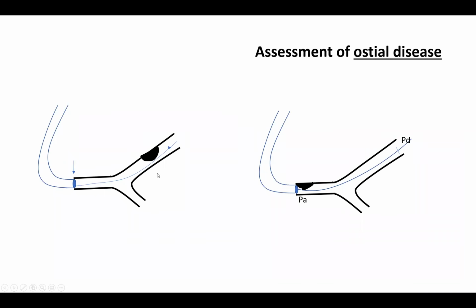So along those same lines of ostial obstruction, how about the patient I was describing, assessing a distal lesion through a moderate ostial disease and ventricularization? How about if you want to assess a more significant ostial disease? Here also, clearly you need to disengage. The guide, again, is preventing hyperemia and is making your FFR and IFR look better.